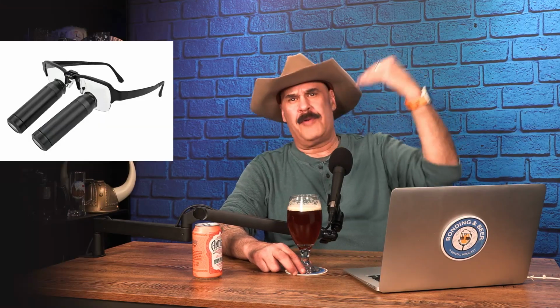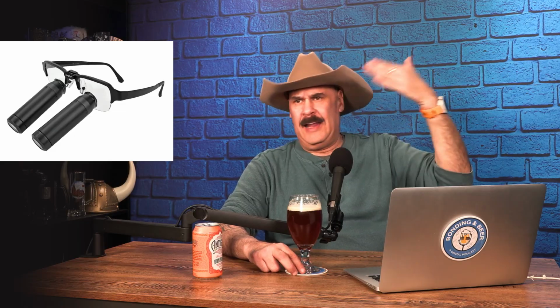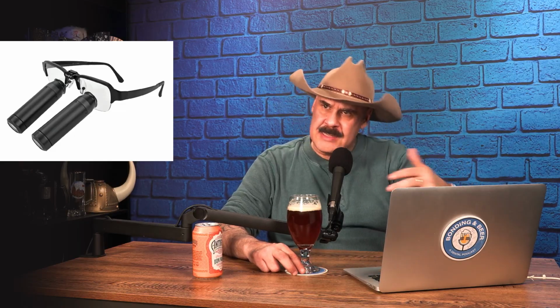I've never used loupes, Rolando. Start with 2.5 or 3.5, and then you start ramping up little by little. At the beginning, you're going to feel a little dizzy. You might get a headache, but as you get used to it, there's going to be a point where you will not be able to work without loupes. I have seen these loupes now that, instead of being straight, they come out a little bit and then go straight down.